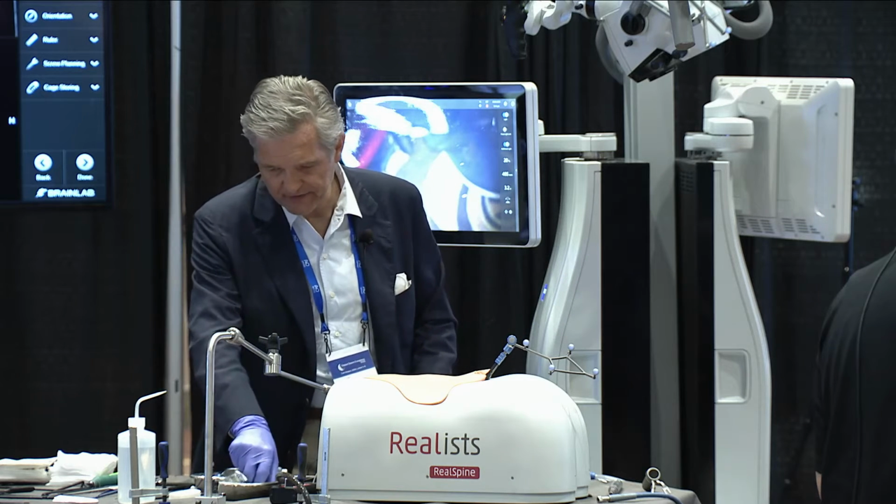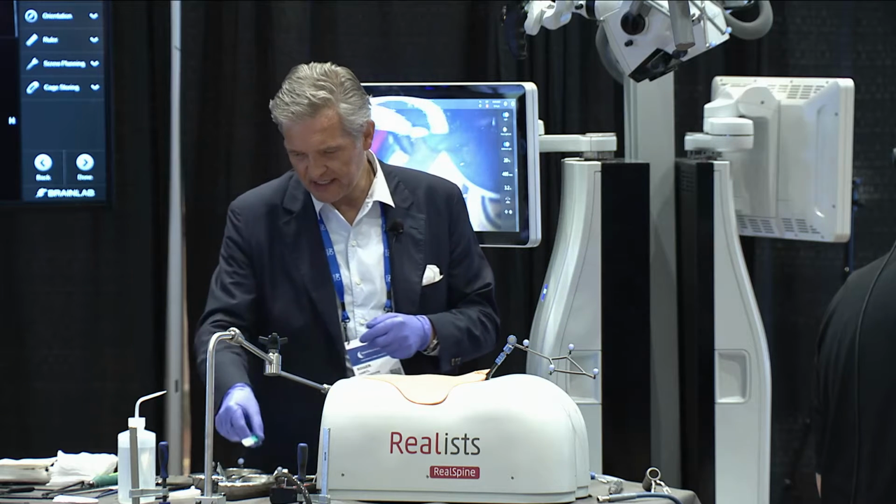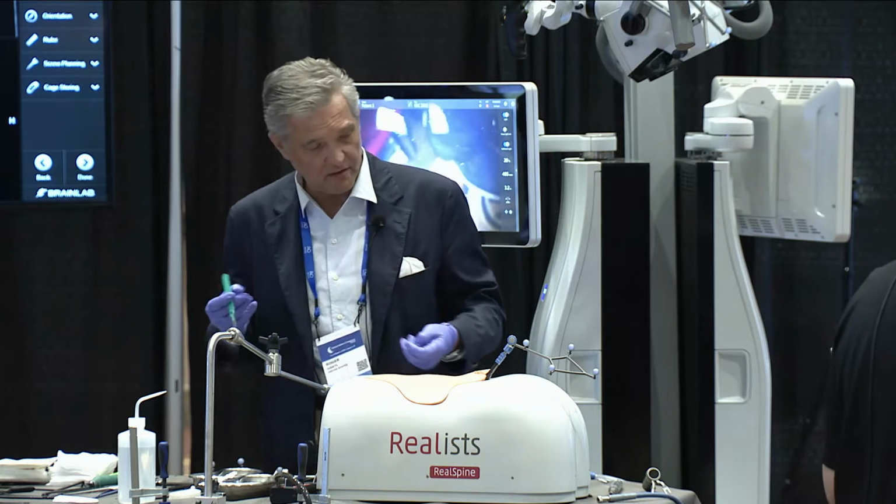Now we have the knife, and I have Andy here, right? Andy is kind enough to help us with some of the instruments that we need for the procedure.